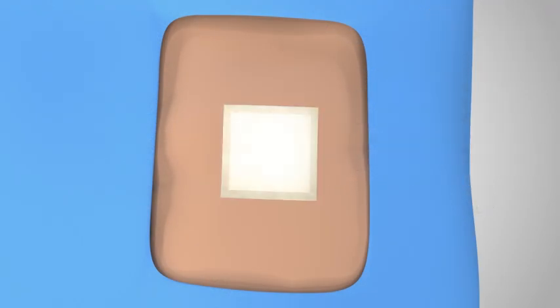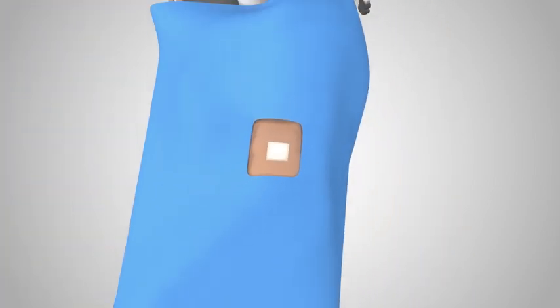Your surgeon will determine what, if any kind of fixation, is necessary during the procedure.